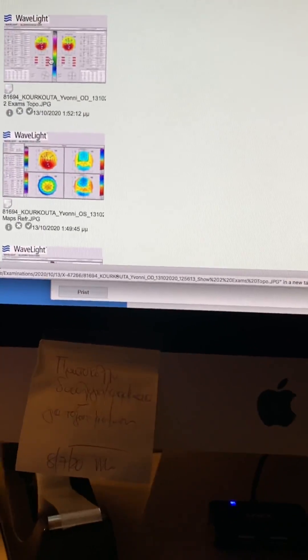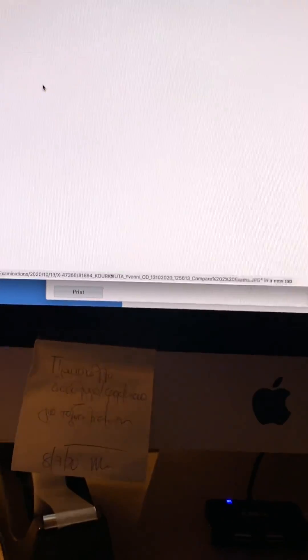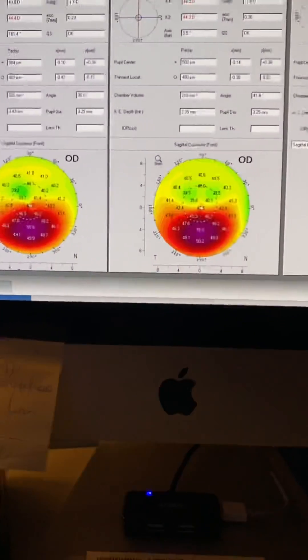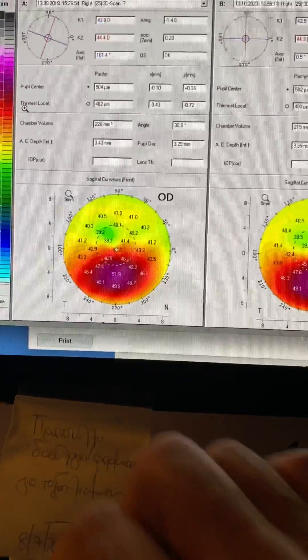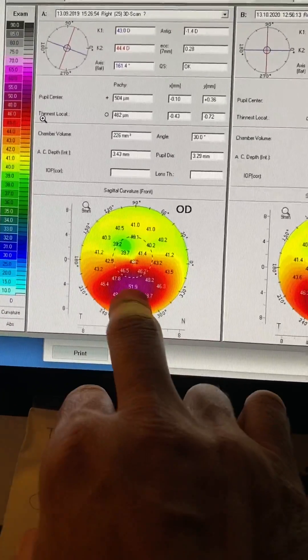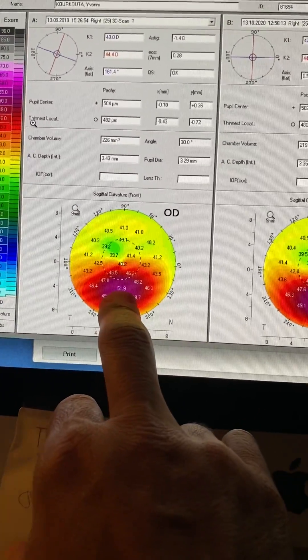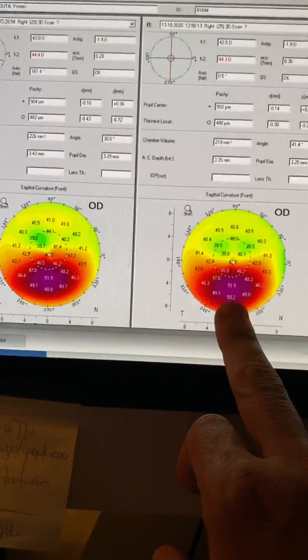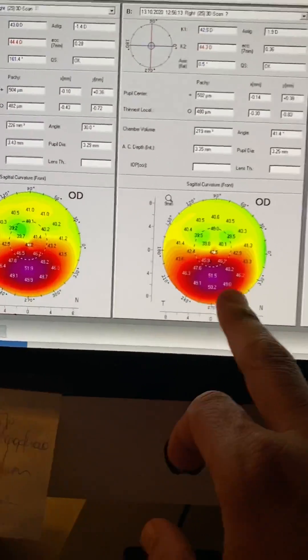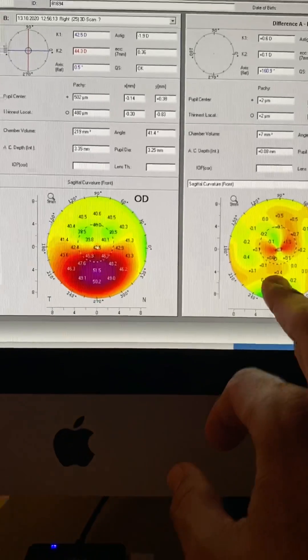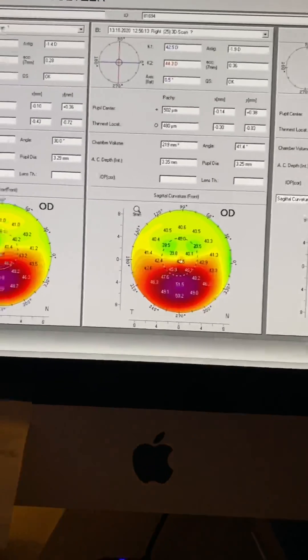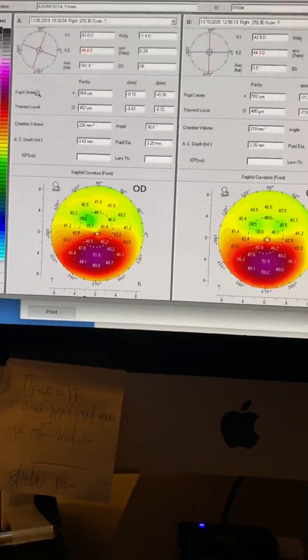Let's go and look at the same parameters on the other eye, the right eye. The right eye is a little bit worse. 51.9 last year, 51.5 this year. An improvement of half a diopter. No change in cornea thickness.